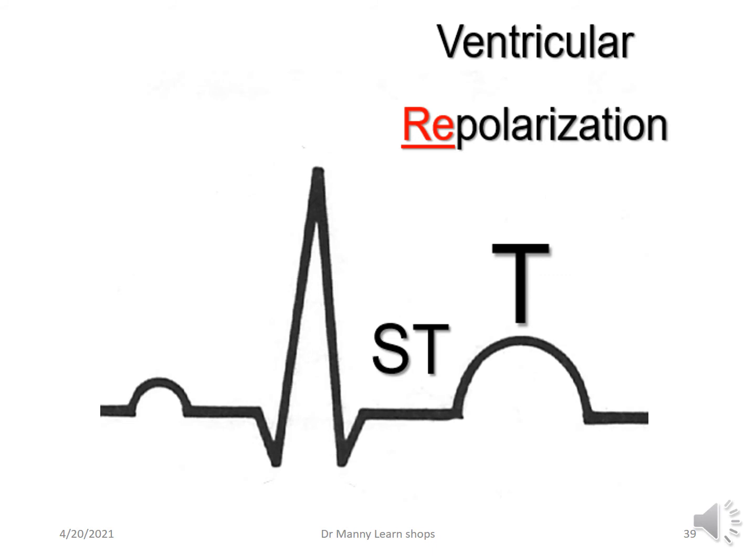Ventricular repolarization, or recharging of the ventricular battery, is represented by the ST segment, early repolarization, and the T wave, a little bit later repolarization, if you want to think of it as that.